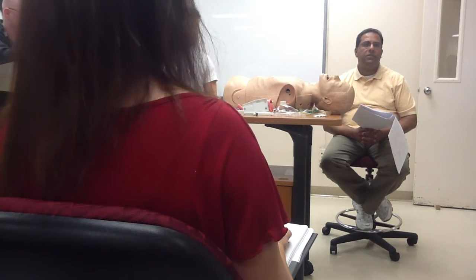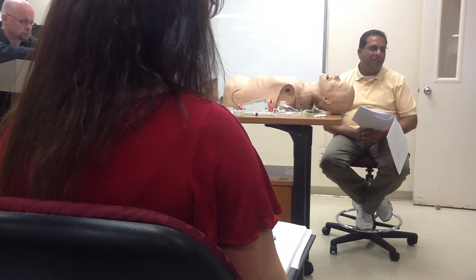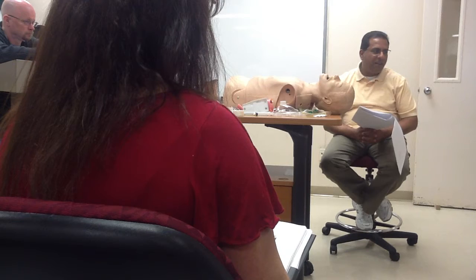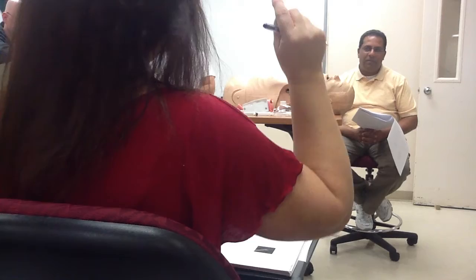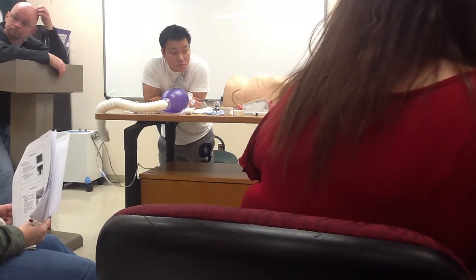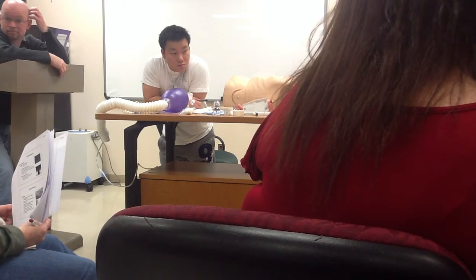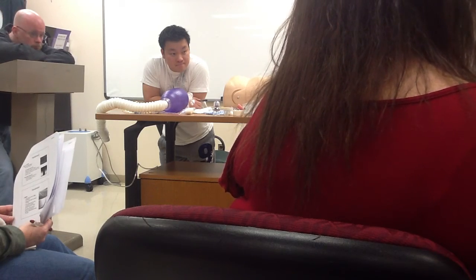Because I've been taking students around, I usually ask them what size the tube is, and they're all looking at different areas. I don't know if they're looking at the right place. This 6 is on there twice. It's at the top of the tube near the mouth, and it's at the bottom also, further down when you're putting it in. So it's actually on the slide. Did everybody see the number on the ET tube? You see the size, and the length is always on it, how far it goes up to.